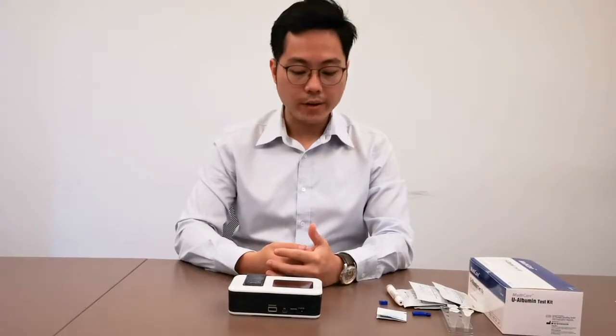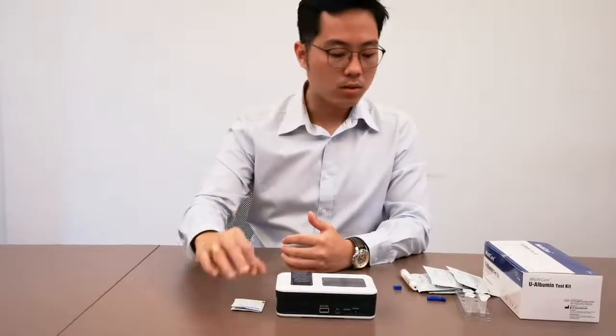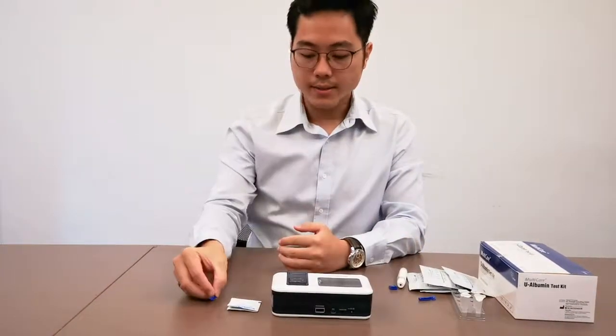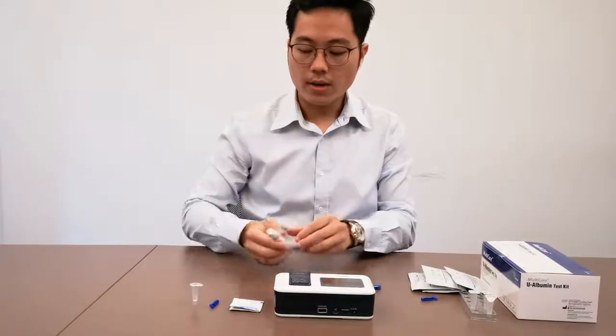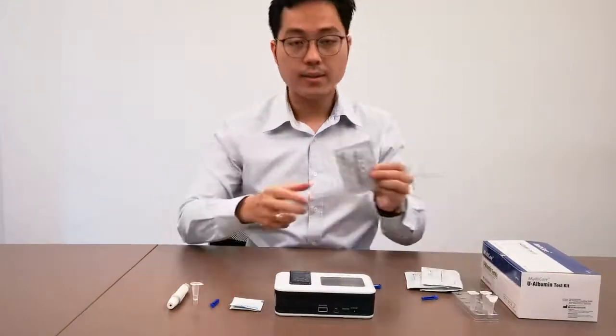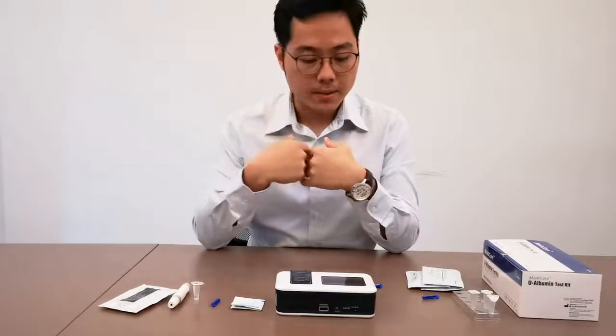So for a start, it's very simple. You need to make sure that you have six items. One is the analyzer, second is the alcohol swab, third is the lancet. You must have your buffer solution, your lancing device, and the test kit. So in total, always remember the number 6.